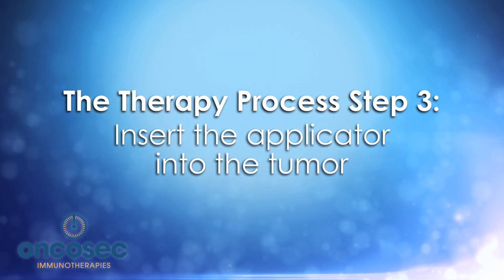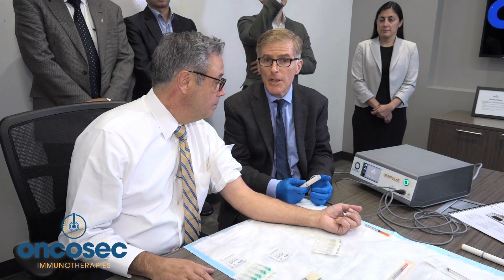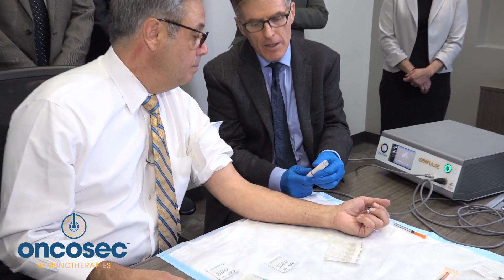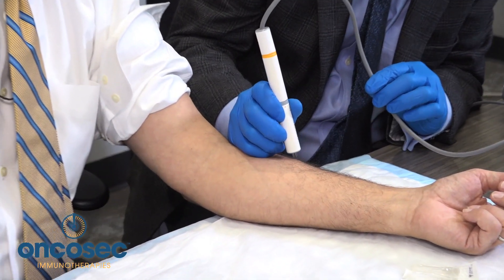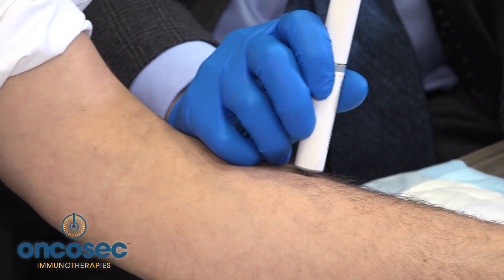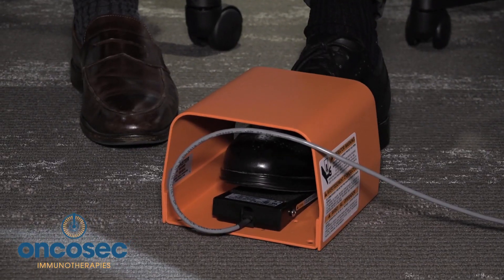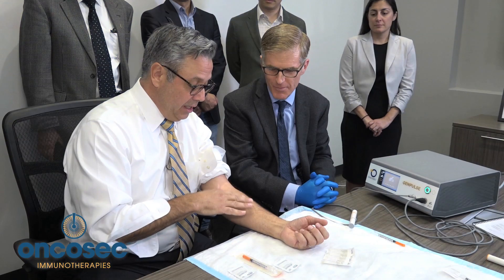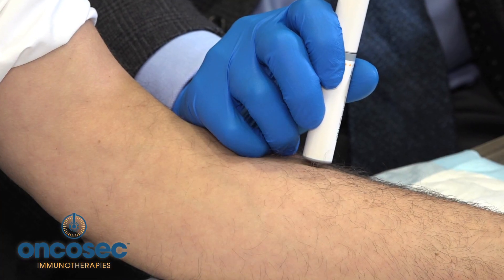Got it. Thank you. The process is extremely simple. I usually advise patients that you'll feel the pulses, but I've electroporated myself and it's usually not a big deal. You extend the needles as much as you need and then put them around the area you injected in the tumor. You'll get them just as deep as you need them, then use the foot pedal to activate the electroporation device. Dr. Al-Ghazi just administered the electroporation after he put in the plasmids in and around my mole, which was situated to look like a tumor. Although pain is subjective, that did not hurt — it's an odd sensation. What hurt more was the needle going in and around the mole area, less the actual delivery of energy.